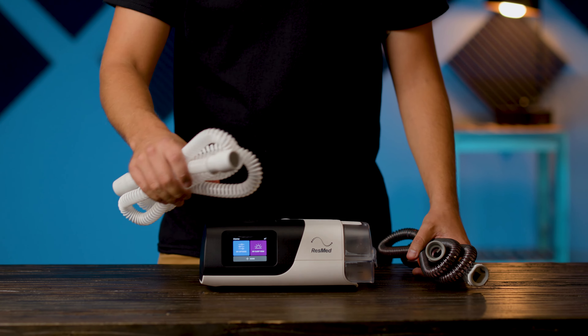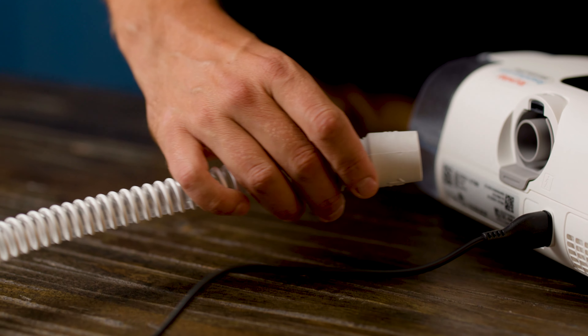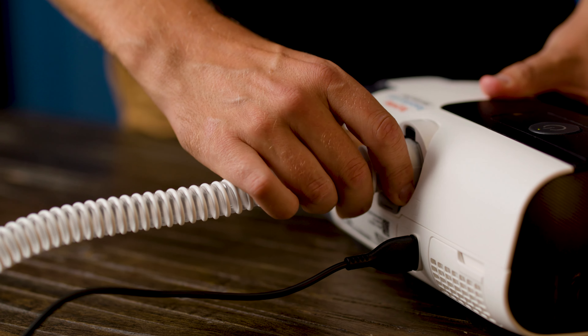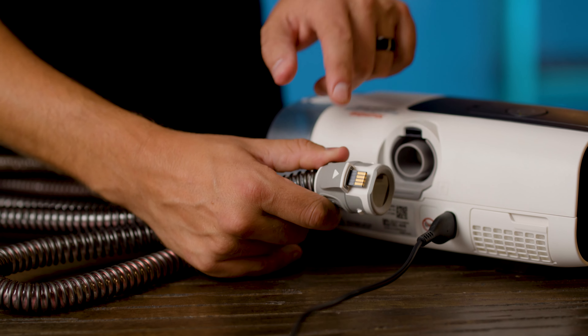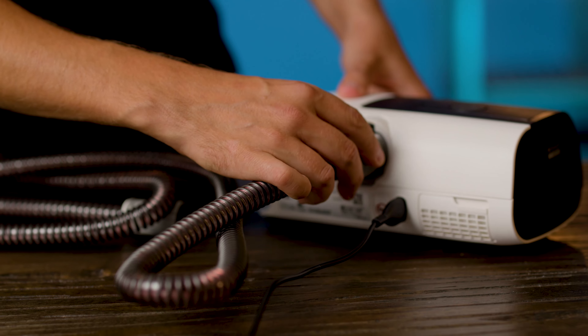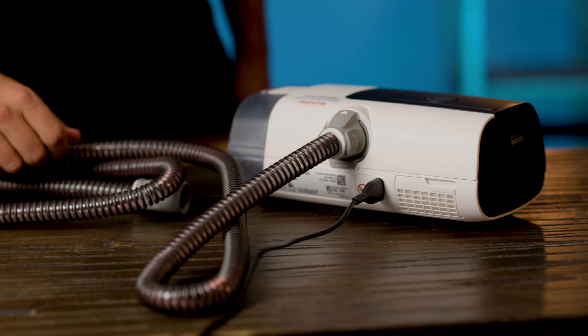Next, get your tubing. The AirSense 11 can ship with two different kinds of tubing. The slimline tubing has a circular connection — simply hold the cuff on the tubing and push it into the ring on the large air connector at the back of the unit. If you have the climate line tubing instead, the tubing cuff will have an arrow clearly marked, which should be turned to face upward. If it is the right way up, the pins in the protrusion should line up with the slot at the top of the connection point. Push the cuff into place until it clicks.